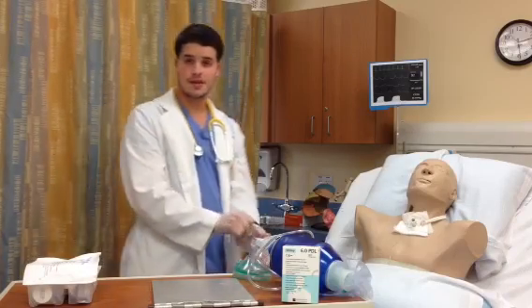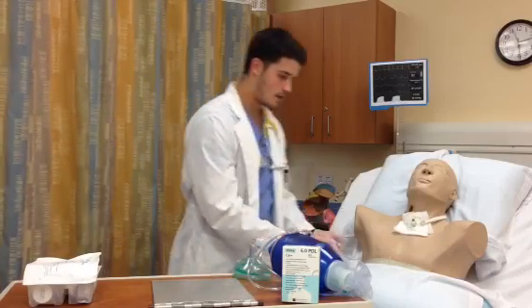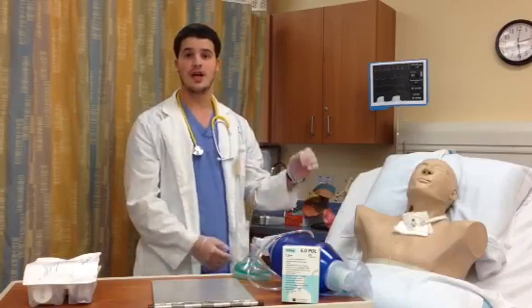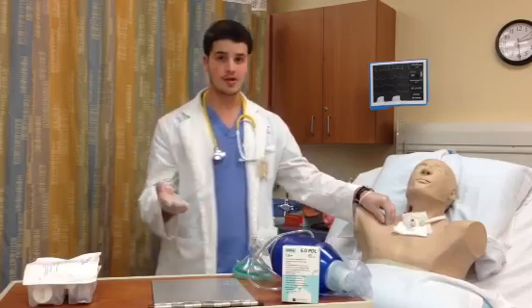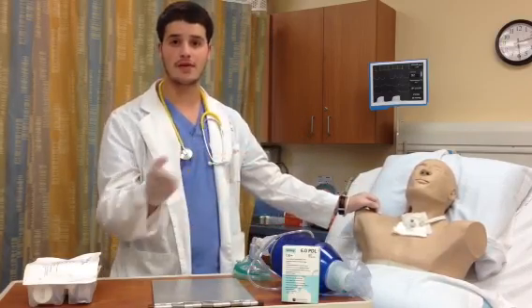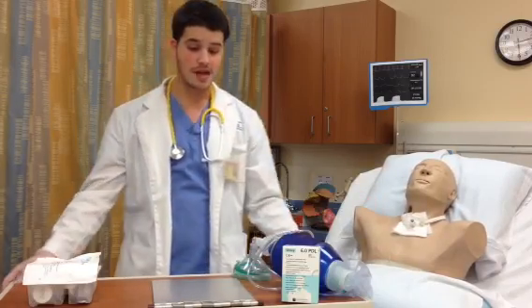I'm going to make sure that this is the correct patient by checking his ID and medical record number. Then I'm going to set the patient up in semi-Fowler position and then check his vitals, which consist of respiratory rate, heart rate, pulse ox, and the breath sounds. If I hear coarse, crackling breath sounds, I will suction my patient, oxygenating him before and after for at least 30 seconds. Now I'm going to set up.